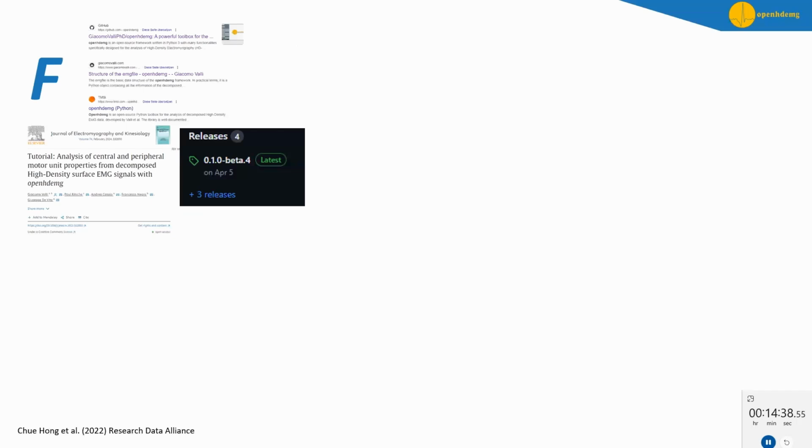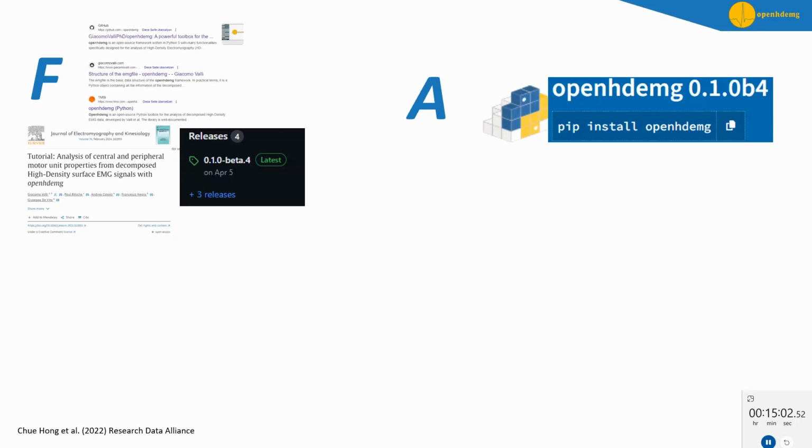And we try to adhere to that with openhdemg. So for the F, findable, we put it basically everywhere where it can be found, right? Put it on Google, writing a tutorial, publishing the paper open access, making dedicated releases, which is very important because then people can reference the release of our software that they're using. For accessible, it's sometimes a bit tricky with software, but we clearly stated how people can access our software. And we also bundled it all together in a package, in a Python package to be exact. So it's very easy to install, right? You just need to download the package. Everything else is taken care of by us.